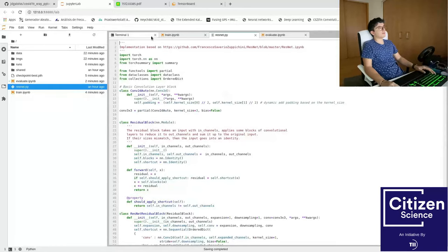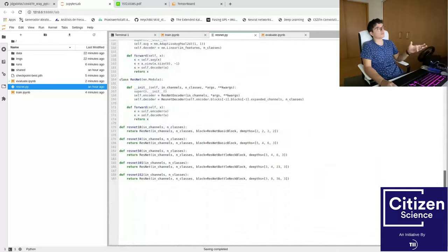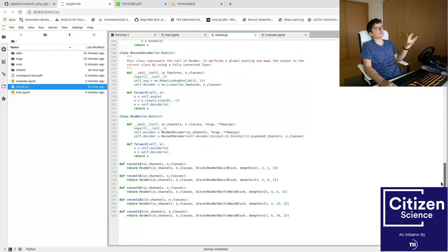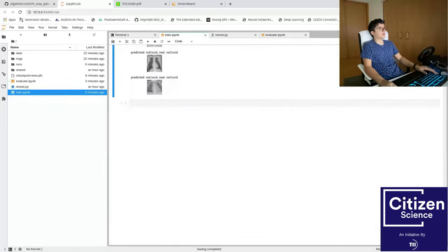So as you saw in the notebook, I used a pre-trained version that I downloaded basically from the Torch Vision Models API. But we could also implement our own model. And what I've done here is I've included code that implements the same model, ResNet, from scratch. So instead of downloading it, we could just use this model. The downside here is that these weights are not pre-trained, so we will also have to download the pre-trained weights and pass them to the model. But this file is included here, and I will show you really quick how it works.